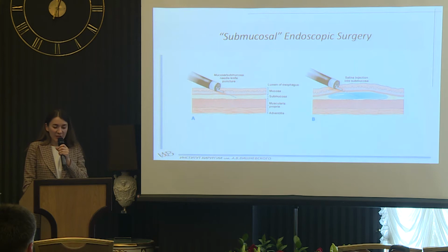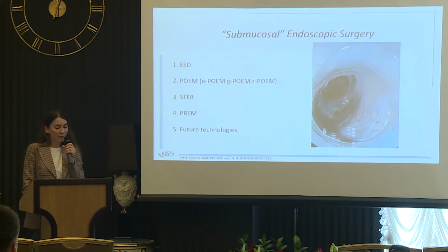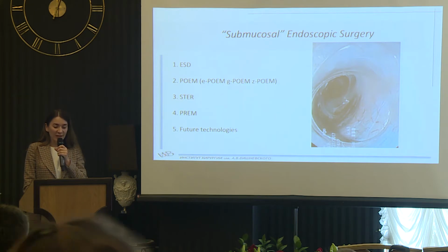Third space endoscopic surgery, also known as submucosal surgery, is based on the principle of approaching the underlying anatomical structures of the GI wall by means of tunneling dissection. That is the creation of a tunnel with no compromising of the mucosa, except the entry to the tunnel, from classic hydrodissection to the new technologies of tunnel creation using balloons. In such a way, all techniques related to third space endoscopy, like those listed on the slide, in fact involve work in the submucosal space.